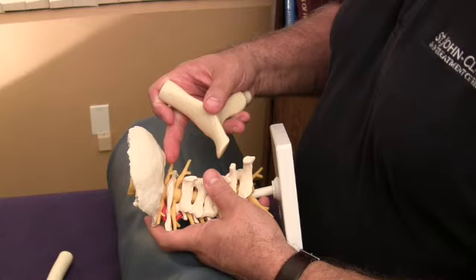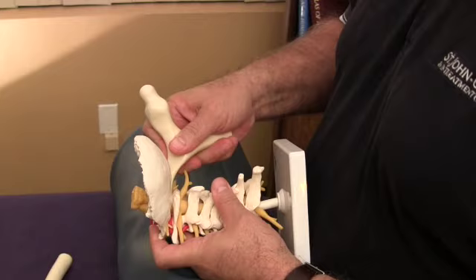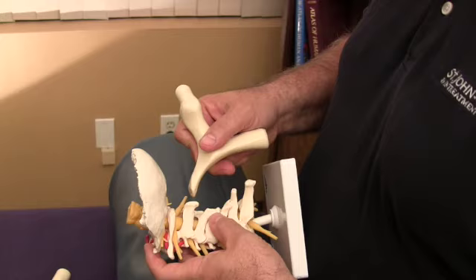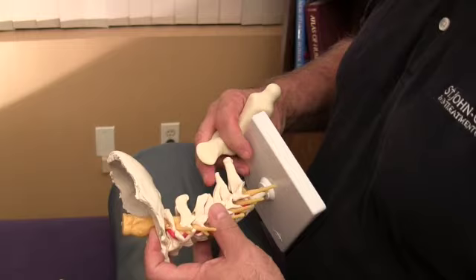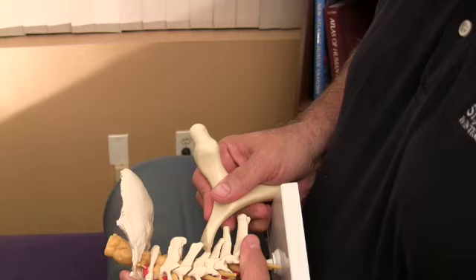You can use it back and forth, in a scooping motion, just like opening up the interspinous muscles. A person who's had a whiplash will have all these compressed together — you can't get your finger in there, but you can see this tool reaches into the interspinous spaces and treats the interspinalis muscles that are really shortened after a whiplash.